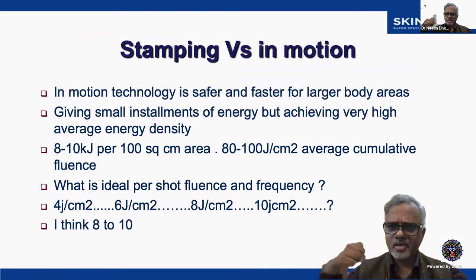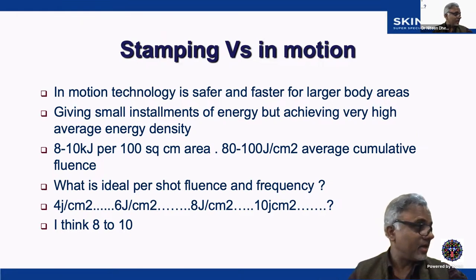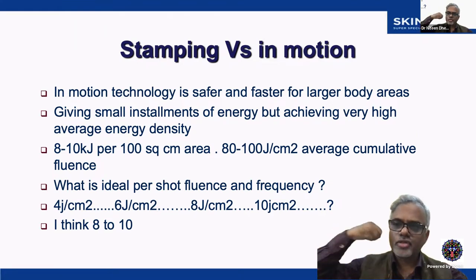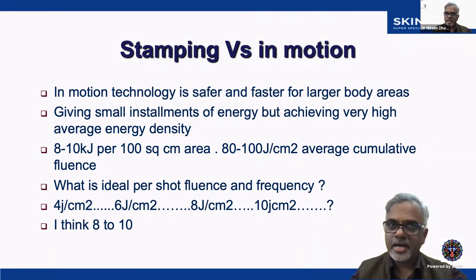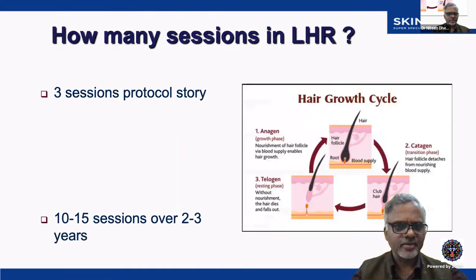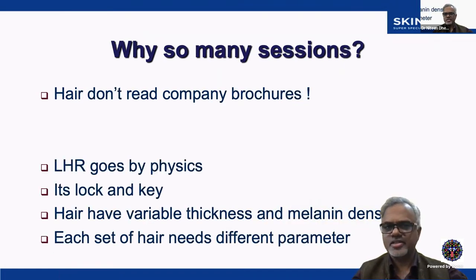So there are different ways how you use that. That will come when you want to learn in detail about laser hair removal. Either you have to stamp one by one shots, or you can use it like a paintbrush. You keep on firing and bulk hit that entire area. That's another new way of doing laser hair reduction. How many sessions? Initially they said 3, then they said 5, now we say 10 to 15 sessions, or 2 to 3 years. That is a typical protocol of laser hair reduction.